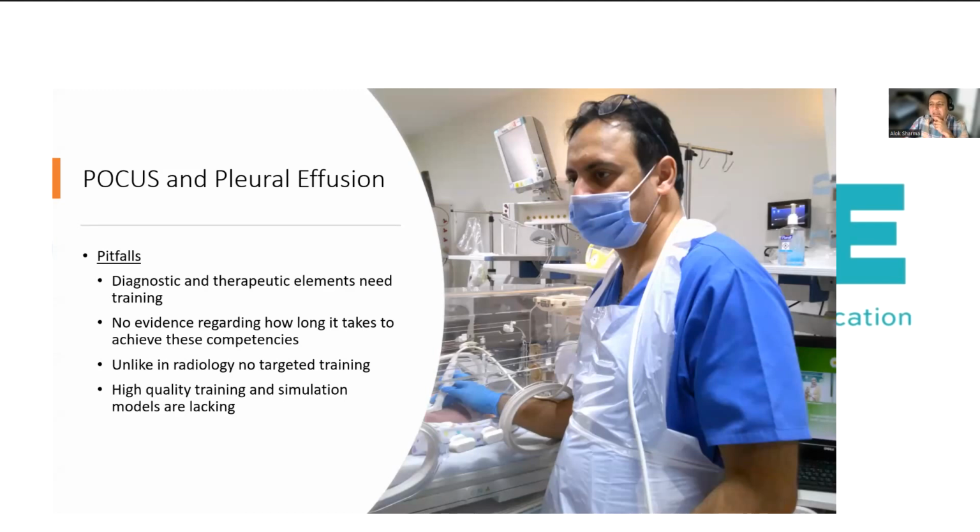For me, the main issues emerging in this area are the training elements. What we must recognize is that we're not radiologists. We're certainly not interventional radiologists, and they clearly go through a huge amount of training. So especially in the countries where you practice, there might be training criteria that you have to fulfill before you can start doing lung ultrasound for diagnosing pleural effusions.